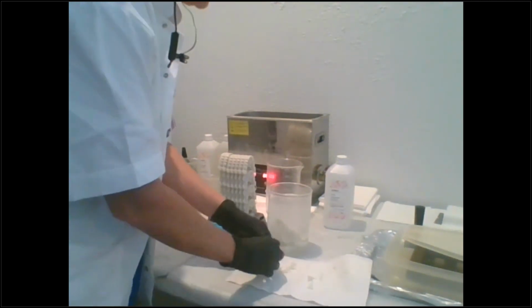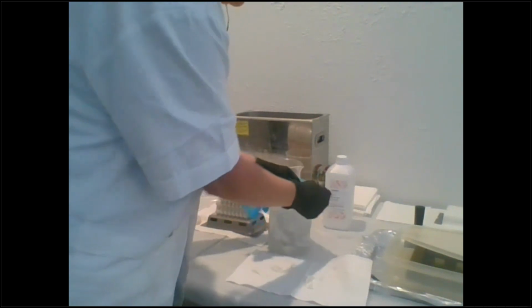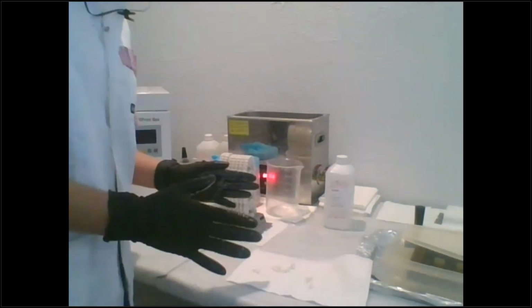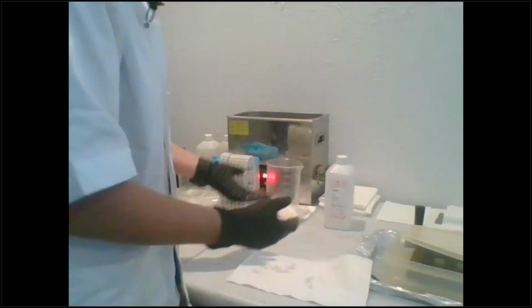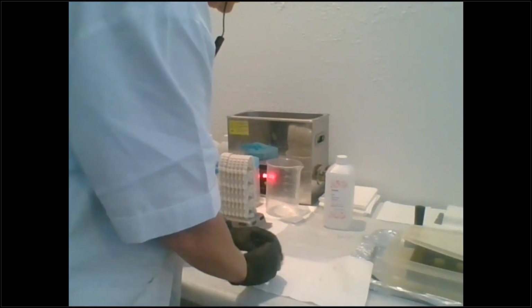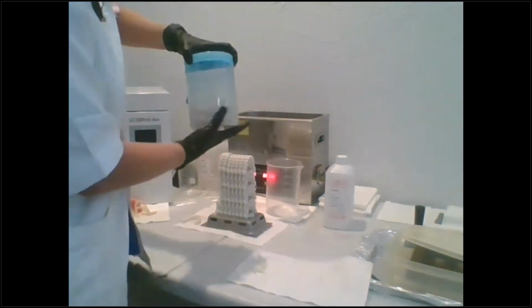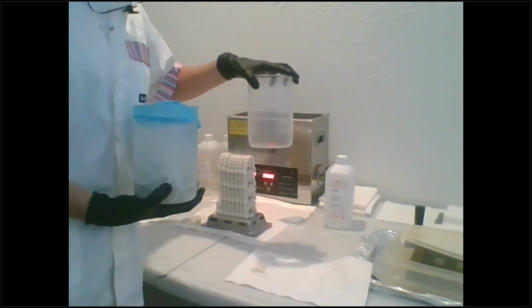So I'm not going to pain you with that sound of the ultrasonic, but I always cover my stuff with a glove and put it in. So 3 minutes. You don't want it to stay in any longer because it'll start being eaten away. Maybe if you were not setting a timer, you walked away for 20 minutes, you came back and said, uh-oh, you might have weaker models or the surface may not be as hard as you would like it to be because you've left it in alcohol. So after you're done with that, you're going to put it into your clean alcohol for 2 minutes.